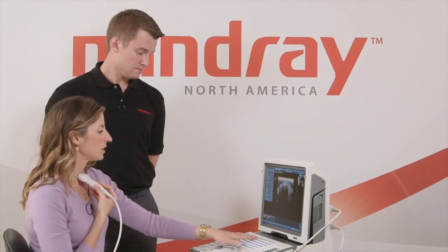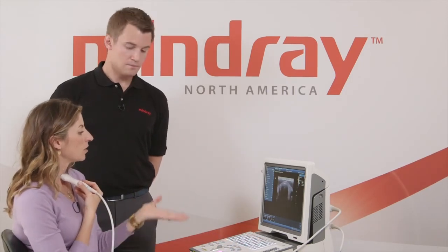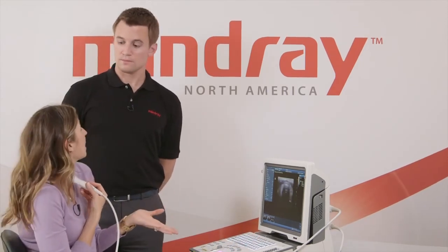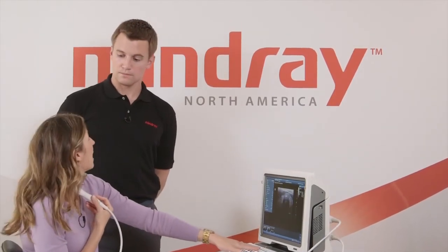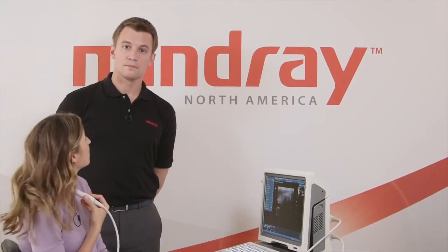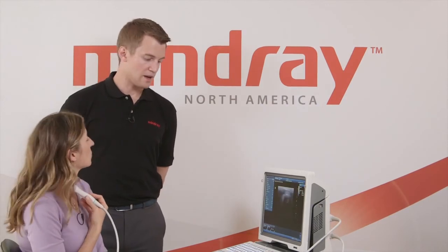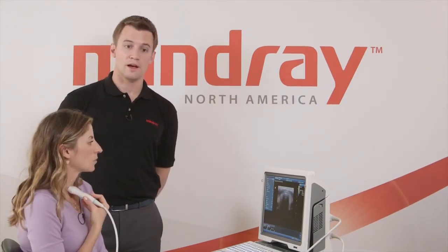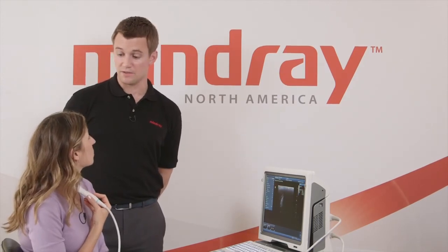All of these function keys are programmable as almost quick keys, and depending on what the account would like during the system setup, you can have your applications person over the phone walk you through how to set up those specific keys. When we discuss the setup portion, we'll talk about how those F keys are programmable. They are in the manuals, and they are also very easy to discuss over the phone.